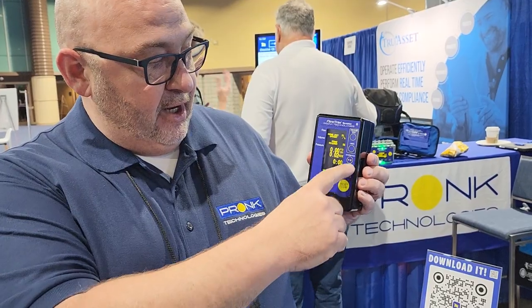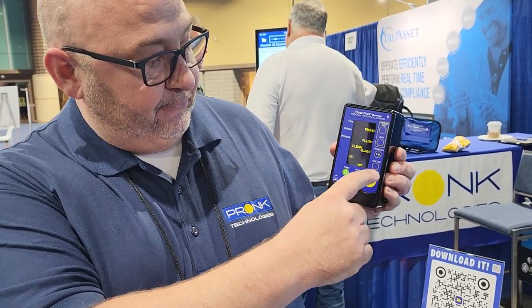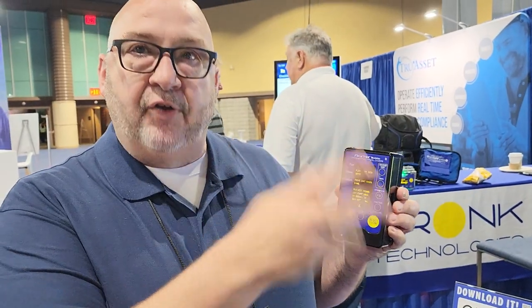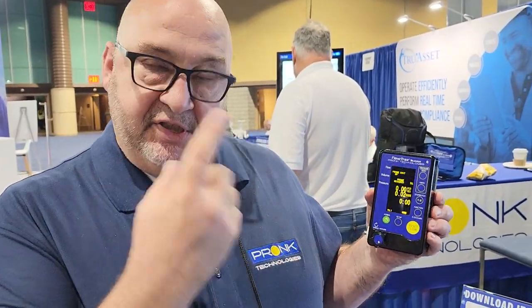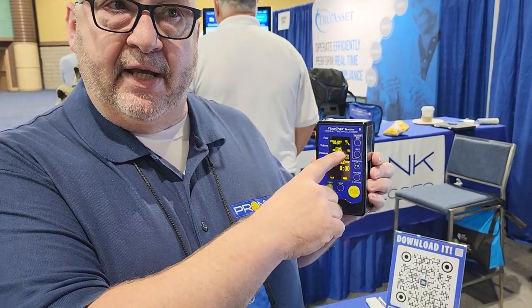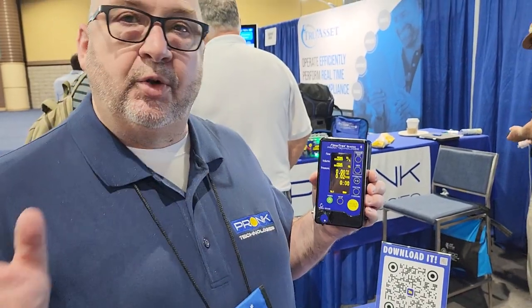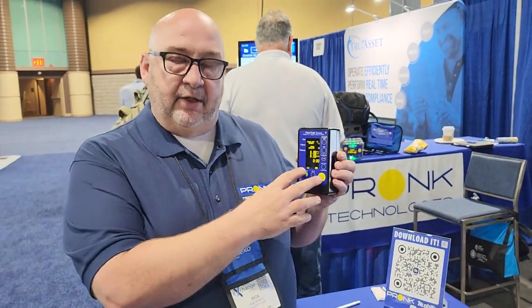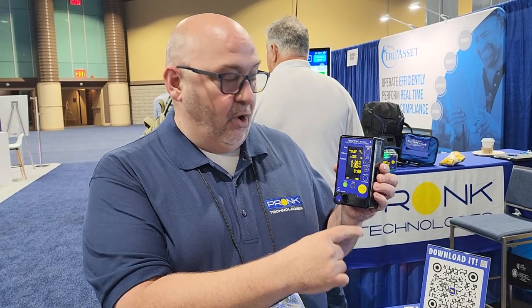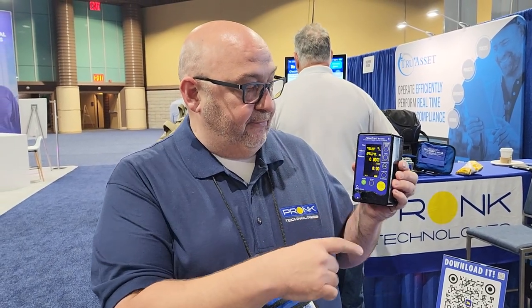Start pumping it through there, then hit the function key and hit flush — that will flush all the air out. Once you've done that, still running at that 900 rate, your prime required may go away automatically. If not, slow your rate down to about 600 and let it run for a few minutes — your prime required should go away. Then you can hit reset flow to zero your readings.